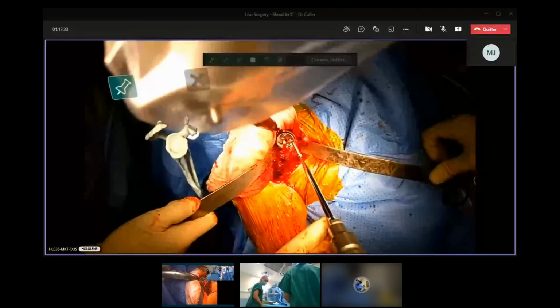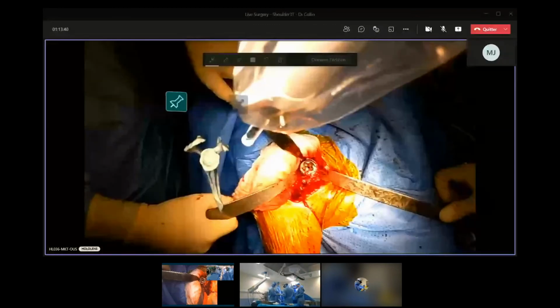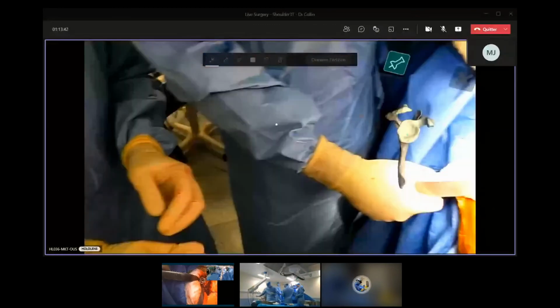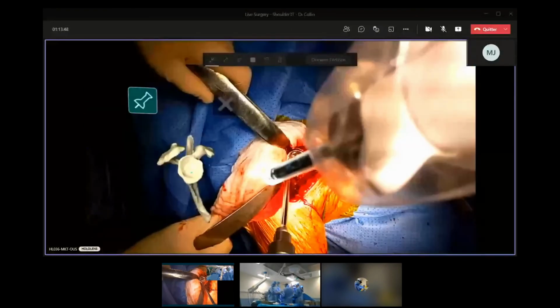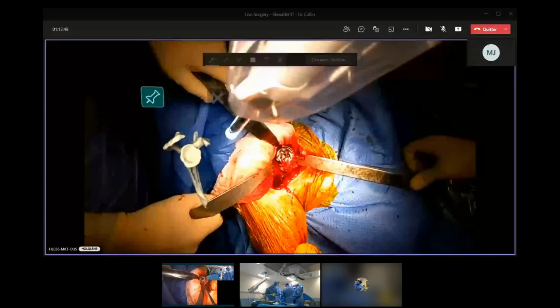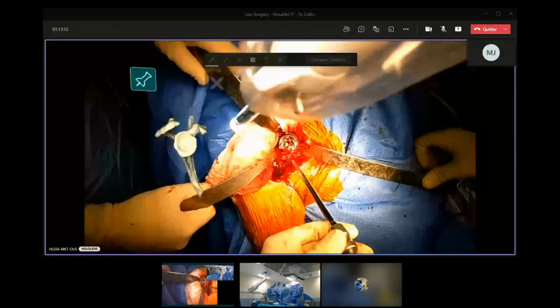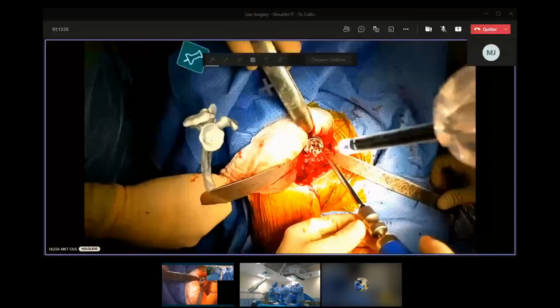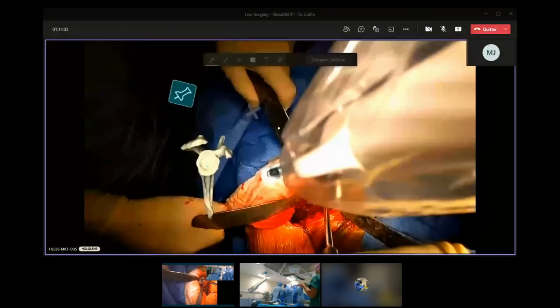So I encourage you to be very, very cautious on the anterior screw and be careful, because you can break everything. Okay. Really, you can finish everything like this. And now it's a locking screw. You can see.